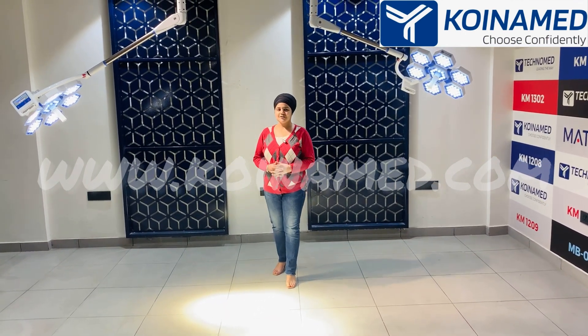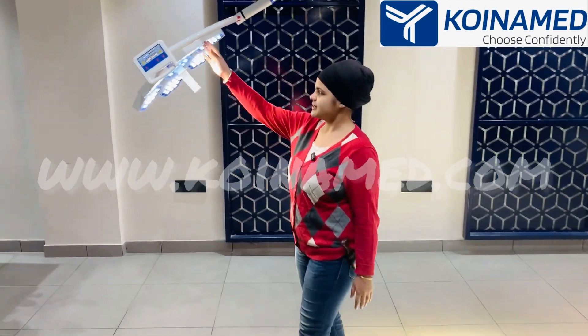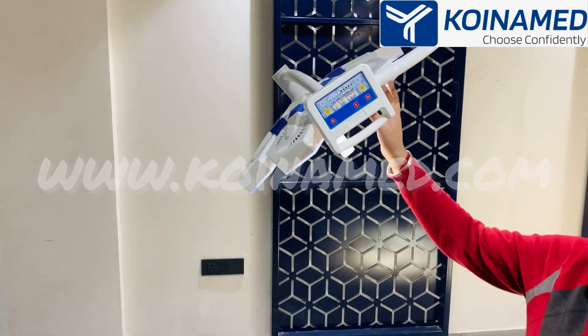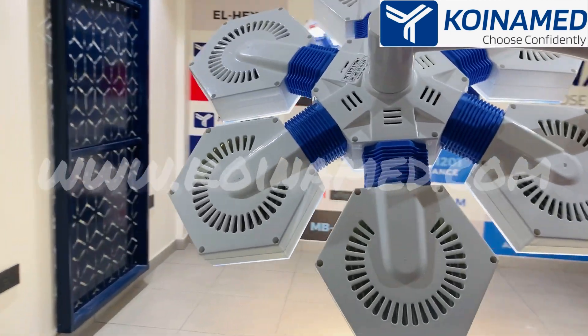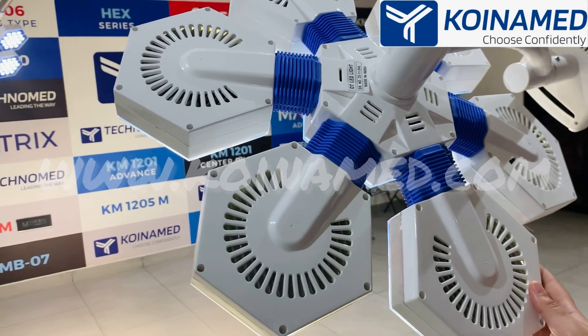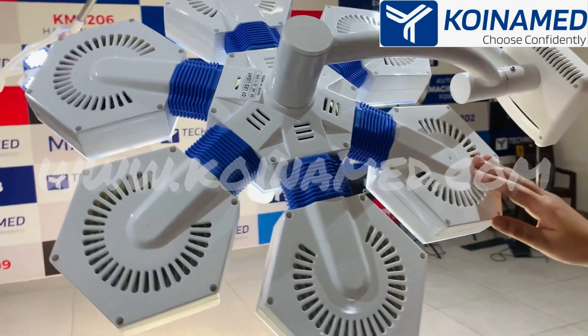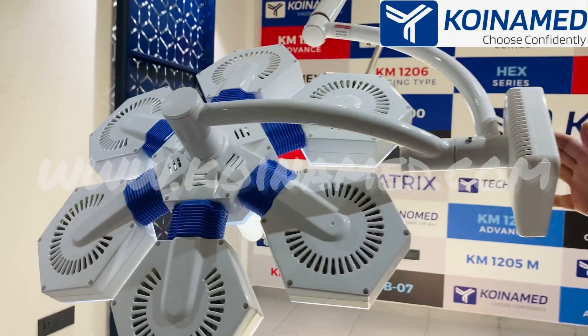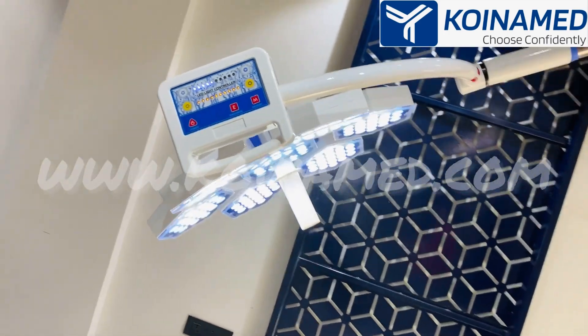You can have a look at this light. It is made up of high quality fire resistant polymer. On the back side, we have provided a European design for heat ventilation. This is a six-fin operation light having a total of 126 LEDs.